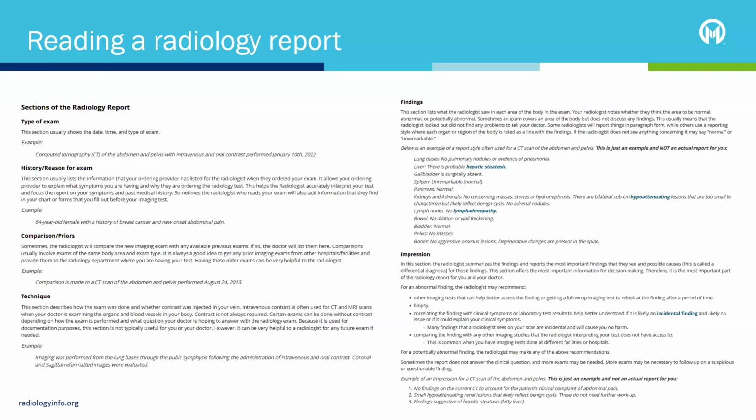And this is actually an example from their web page that I'm going to use here, just to describe what we call in radiology different imaging modalities. So when I say different modalities, that's what we have: X-rays, ultrasound, CT scans, MRIs. They're all considered different modalities of imaging.